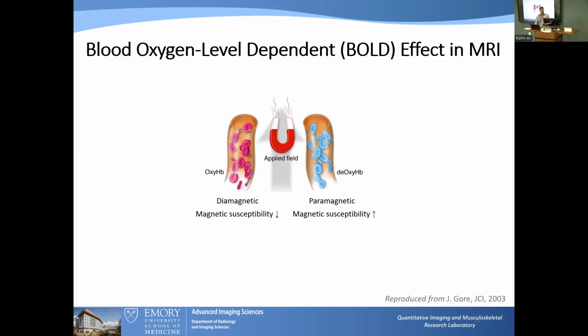So this is all really important because ultimately we want to be able to measure that cellular activity within the pancreas. And so there's a very beautiful MRI method called BOLD MRI, or blood oxygenation level dependent MRI, that was developed decades ago in the functional MRI domain.